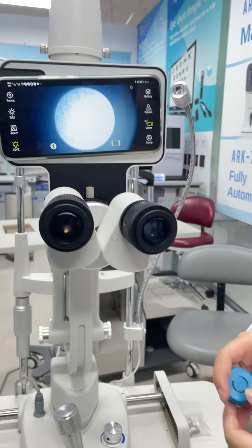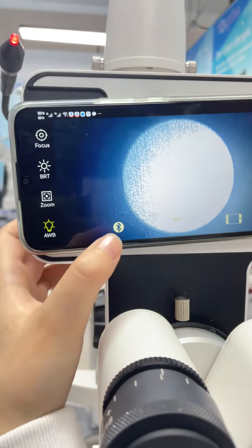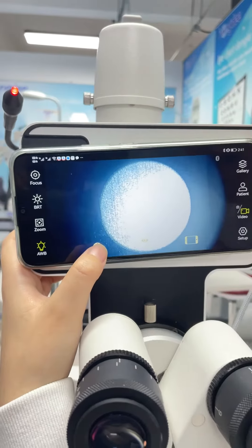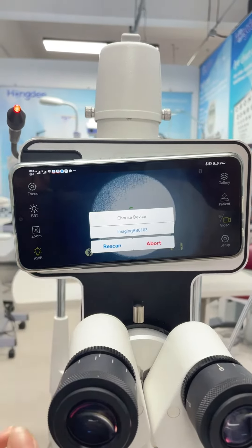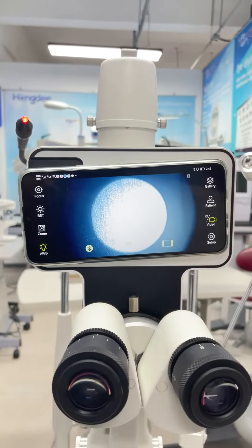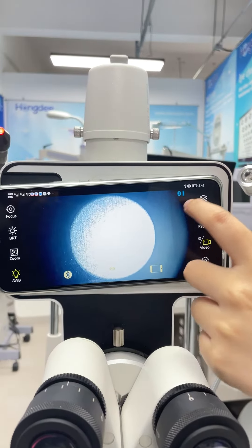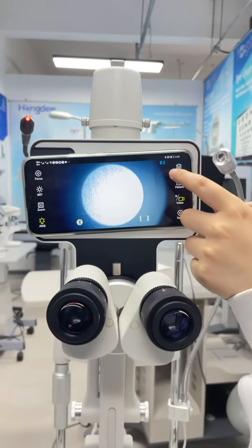First, before taking a photo, we need to connect to the Bluetooth. Just press this Bluetooth button and click. So just wait a minute. You can see the button is changing to blue.